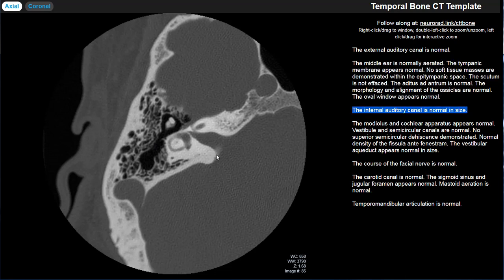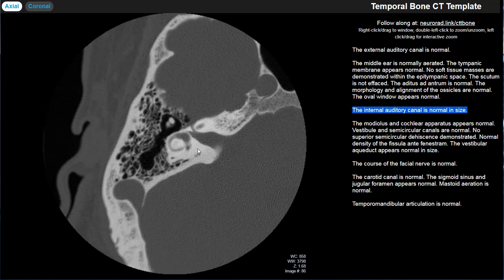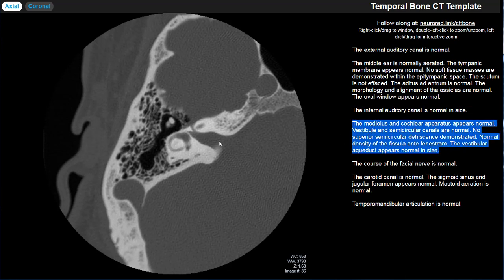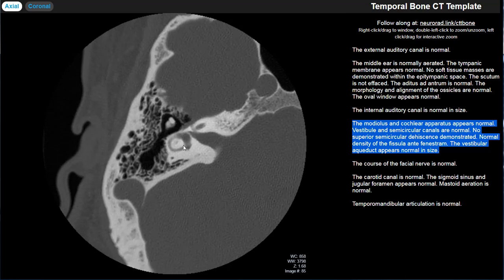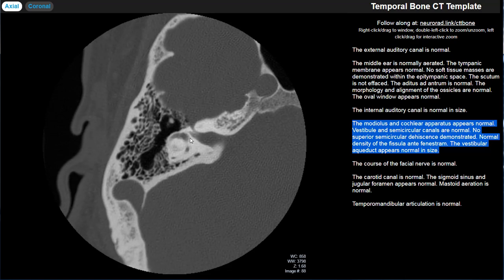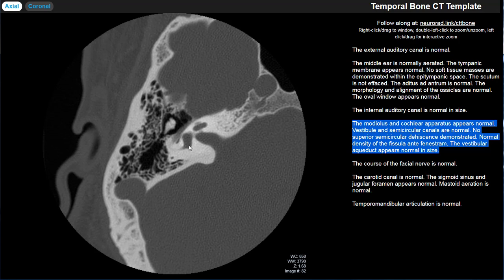Moving all the way medially, we have the internal auditory canal. I comment on whether it's normal in size — a large vestibular schwannoma might cause scalloping, though that's not a very common observation. Then we move on to the inner ear. The inner ear is surrounded by the otic capsule — the very dense bone of the petrous temporal bone. Within the otic capsule are the labyrinthine structures: the cochlea, the semicircular canals, and the vestibule.